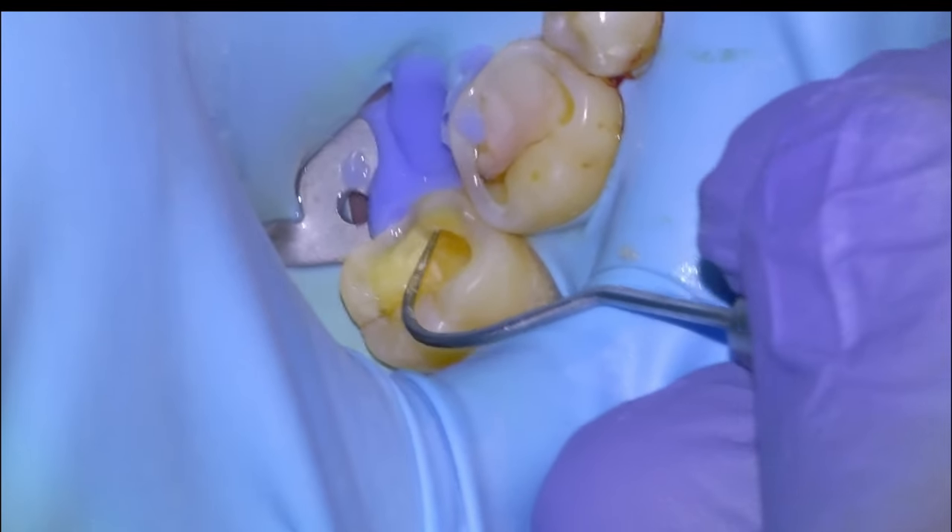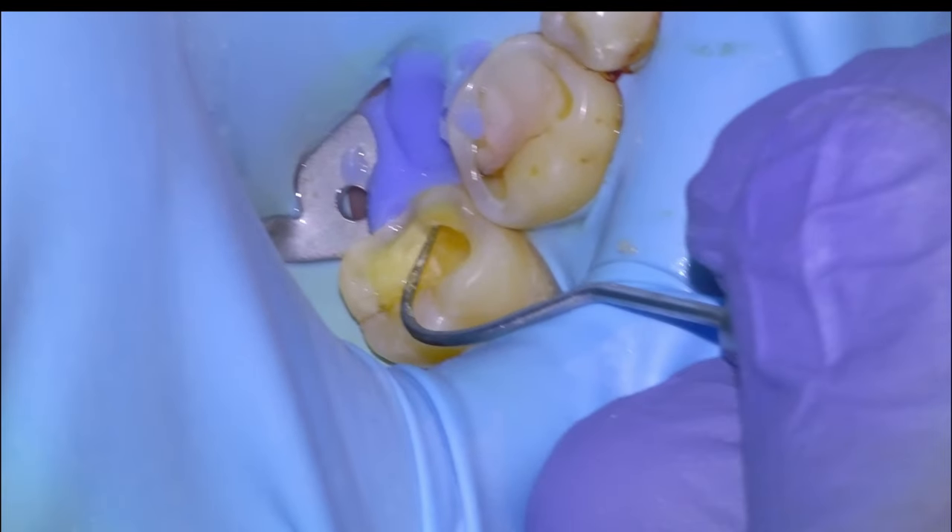You can see that little crack on the distal surface. A crown is an option, but this tooth was not symptomatic and I don't see enough of these things split to recommend crowning routinely unless it looks really scary or they have cracked tooth syndrome. So direct restoration is going to do just fine for this tooth long term.